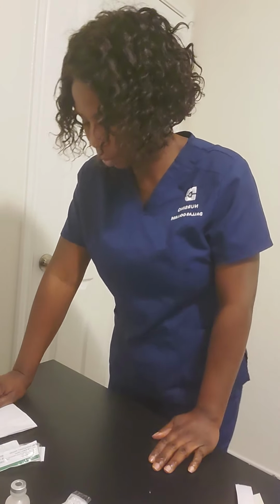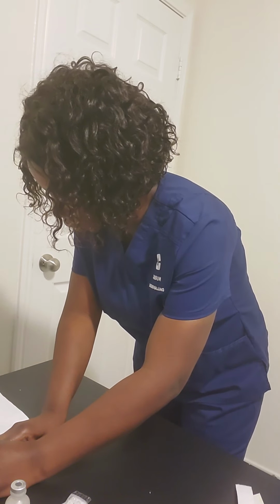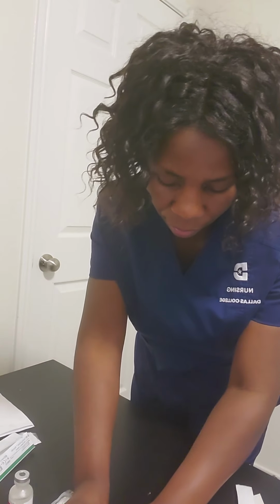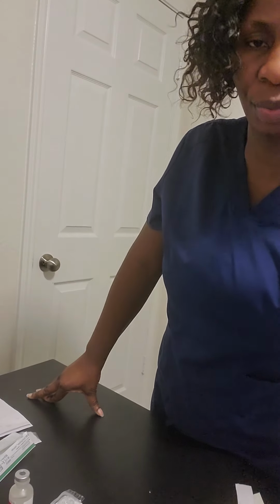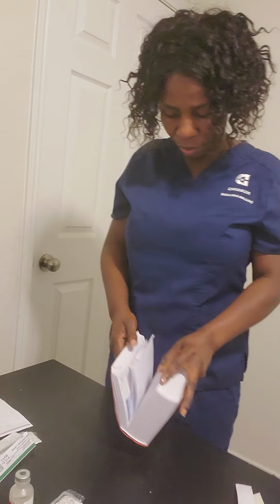So I'm going to confirm what I have: ceftriaxone, sterile water, needle and syringe, PPD, tuberculin syringe, NPH and regular insulin syringe. So I've been able to pull the correct medication, and to confirm the dosage, I'm going to be going to the nursing drug reference book, looking for the medication and the dosage and the usage in the book and side effect. Here I have ceftriaxone.